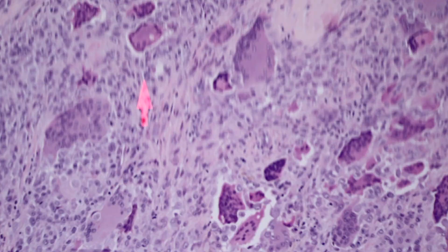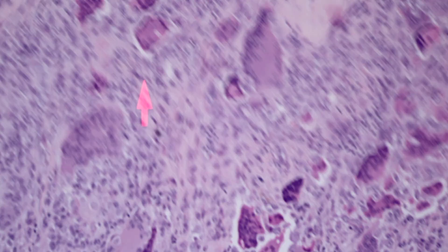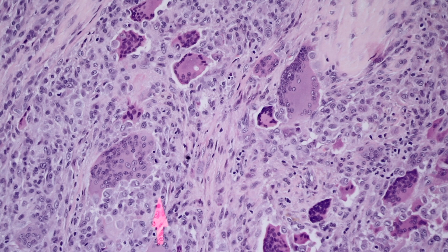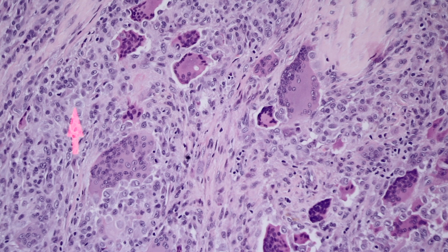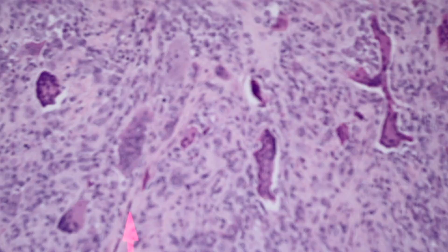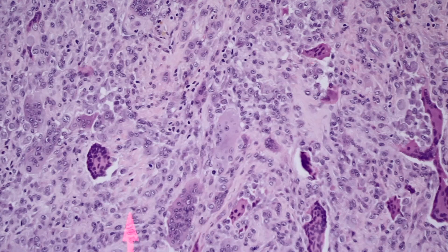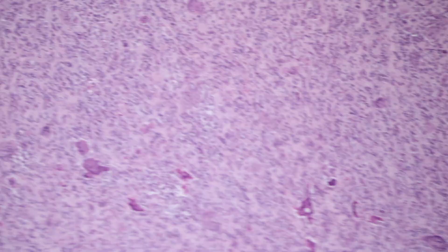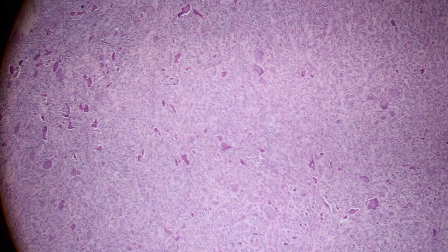At higher power, you can see the osteoclastic-type giant cells. They sometimes have several nuclei — three, four, five — and other times they may have numerous nuclei, 20 or 30. They're scattered in a background that contains many mononuclear histiocytoid cells. These histiocytoid cells are actually the neoplastic tumor cells. The giant cells get recruited in and come hang out in the middle of the tumor. Learning to recognize these histiocytoid cells in the background is one of the keys to recognizing tenosynovial giant cell tumors. They'll be in sheets and sometimes in little cords in a really sclerotic and hyalinized background.